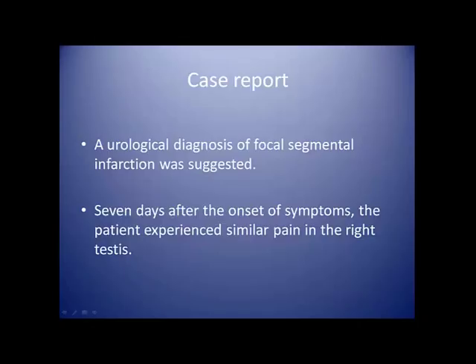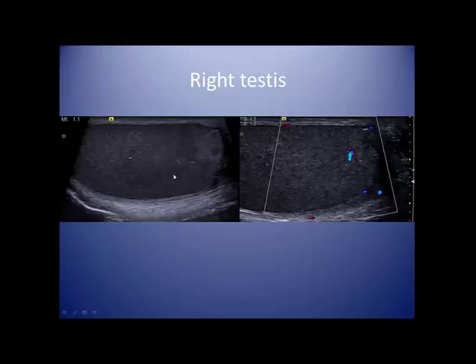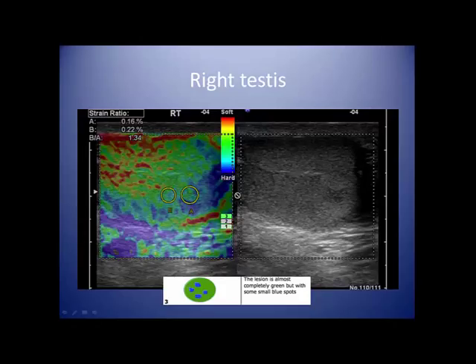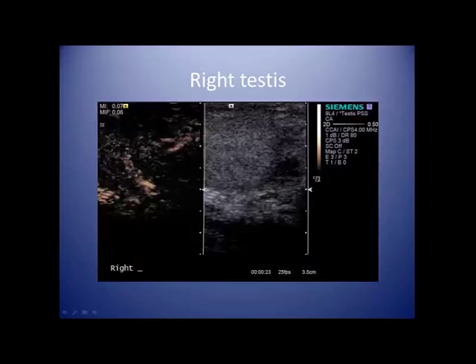A urological diagnosis of focal segmental infarction was suggested. Seven days after the onset of symptoms the patient experienced similar pain in the right testis. Examination of the right testis showed abnormalities at the lower pole with hypoechoic and hyperechoic areas. No internal vascularity on Doppler; the lesion on RTE is almost completely green but with some blue spots — grade 3, still a soft lesion. On administration of microbubbles, there is no internal or peripheral enhancement in particular.